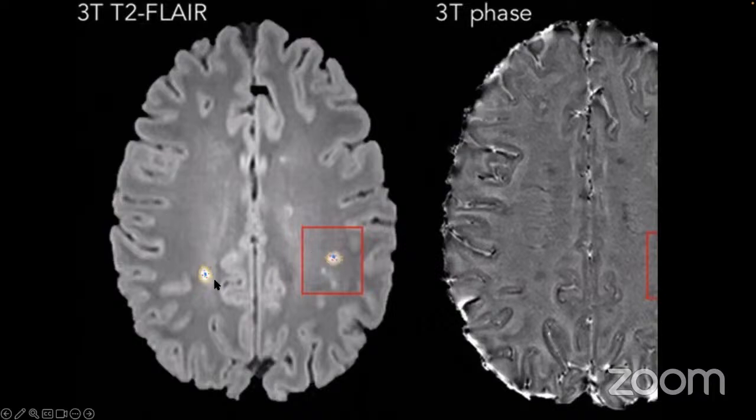And this is really a very nice imaging trick that allows us to predict that this is a chronic lesion, because these activated microglia release reactive oxygen species that we have discussed, and these reactive oxygen species are able to oxidize iron either within the blood or within the cells.